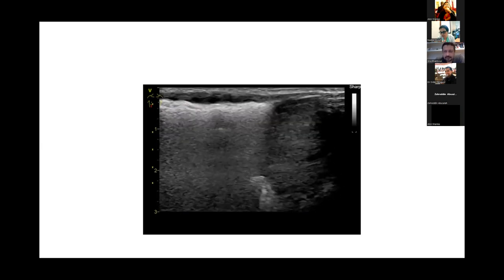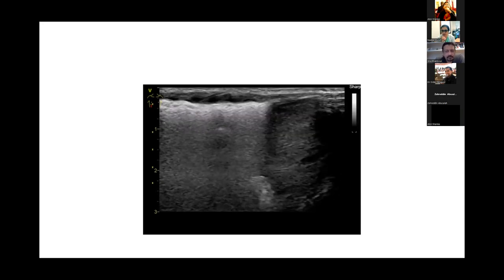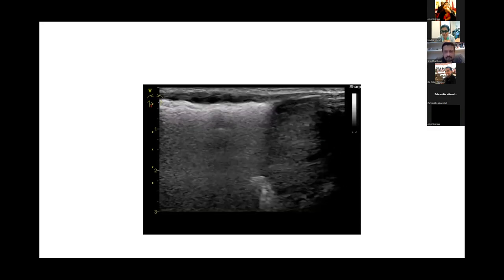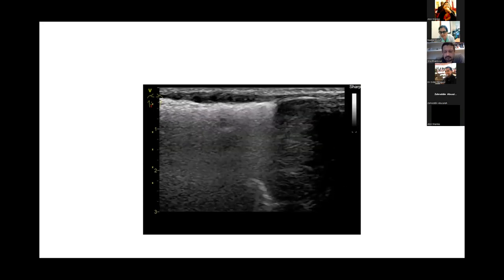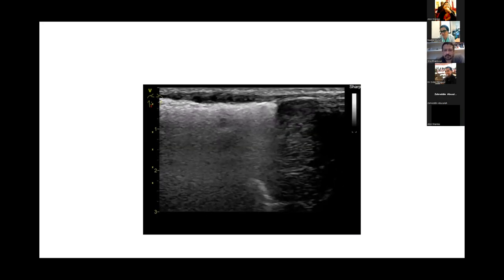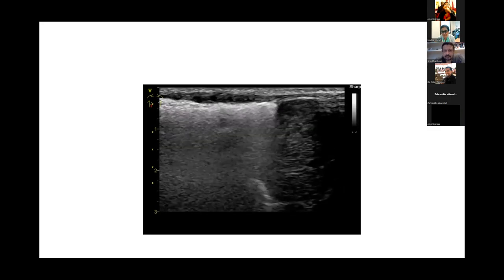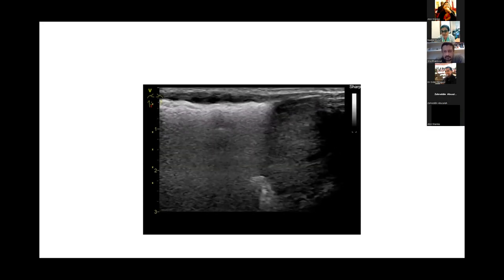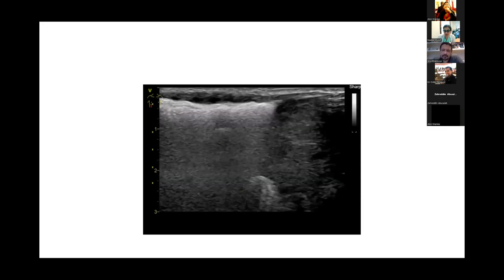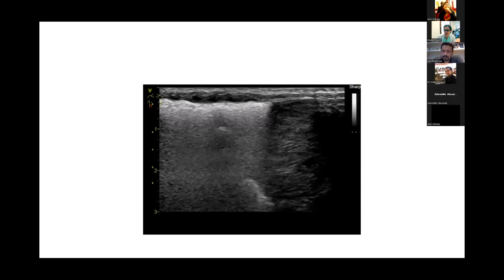Yes. And we are not seeing this here. This is predominantly white. You always have to start at the pleural line. Stuff that's in the middle doesn't make any sense. It has to start at the pleural line. Is this maybe mirroring from the abdomen? Is it maybe an A line? I don't know what it is. Maybe it's an A line, but I know it's not an area of emphysema that I can pick up. If it is, it is hidden somewhere. The change always has to start at the pleural line.